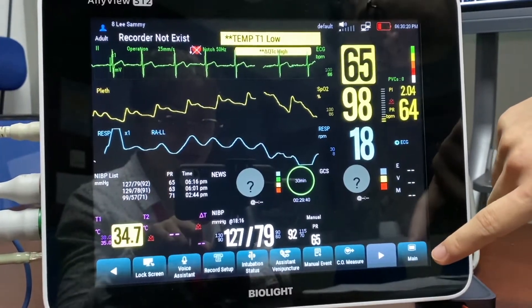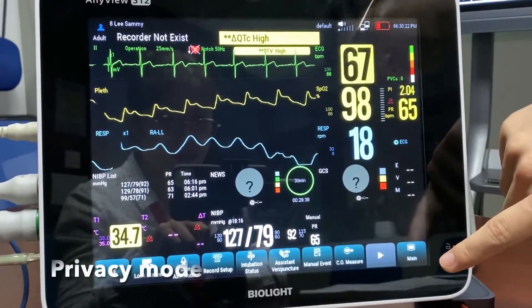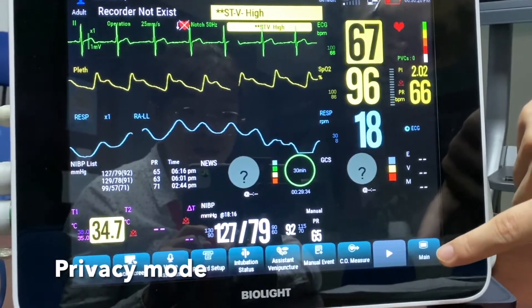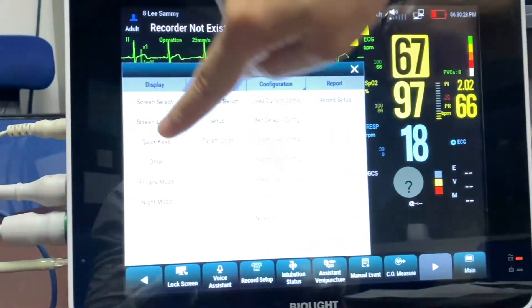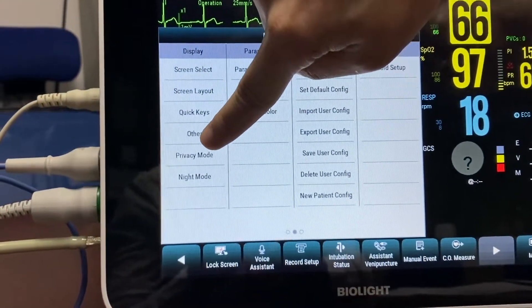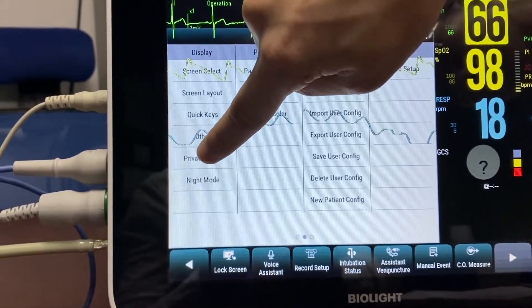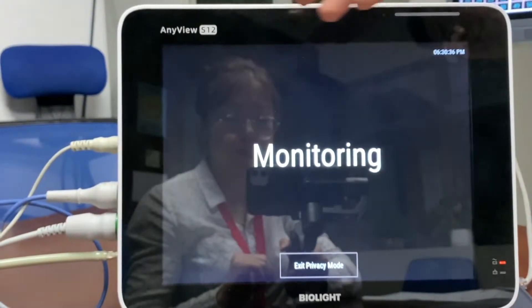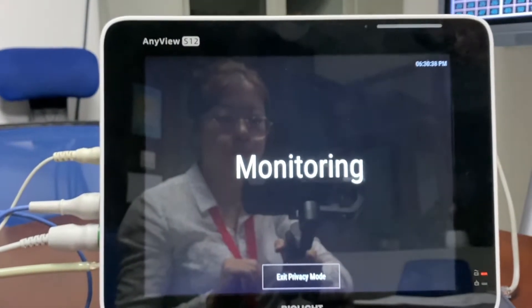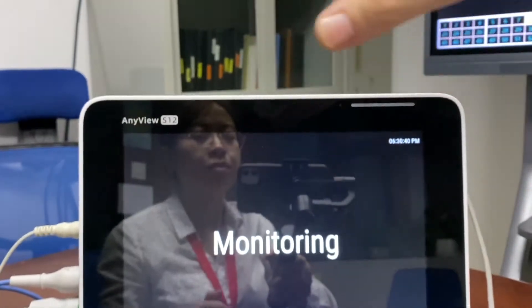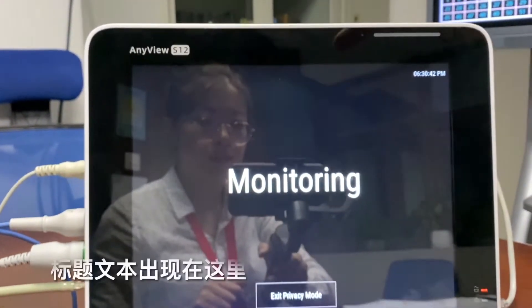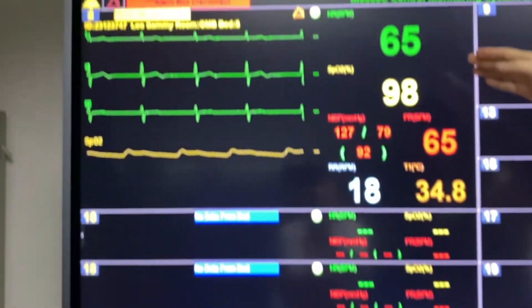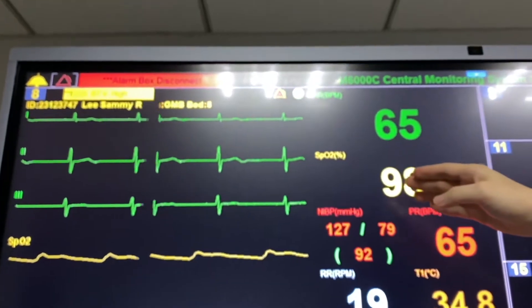If the patient is concerned about their privacy being revealed to the public, we can always go to privacy mode. We can click on the main button and go to privacy mode. The monitor will switch to a privacy mode display screen while continuing to monitor the patient, and the CMS will still display the patient's waveforms at the nurses' station.